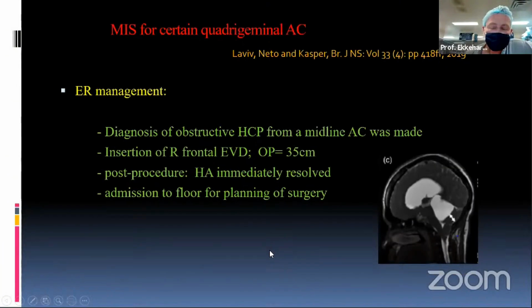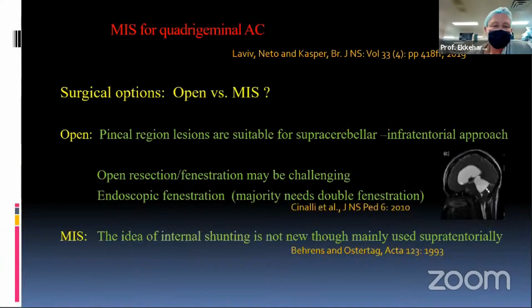Because she was in the ER and really not doing well, we decided to place a frontal EVD for emergent treatment, and opening pressure was 35. The headaches immediately resolved, and then we admitted her to the floor for further treatment planning.